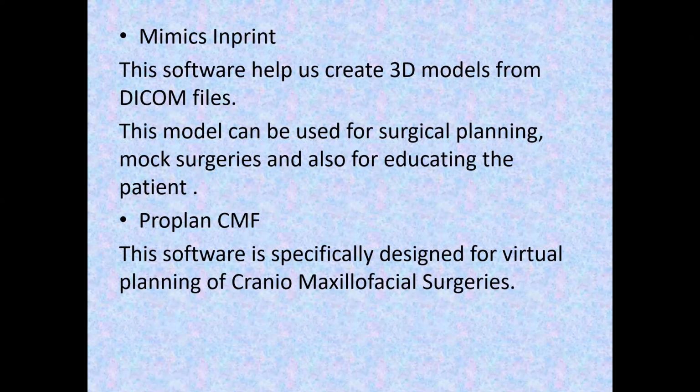Now the question is, why do we require a 3D model? We require a model so that we can easily do surgical planning or mock surgeries on it, and it can also be used for educating the patient or the students about how the surgery is carried out.